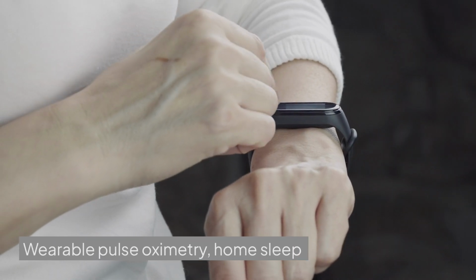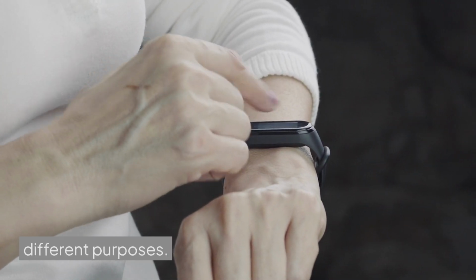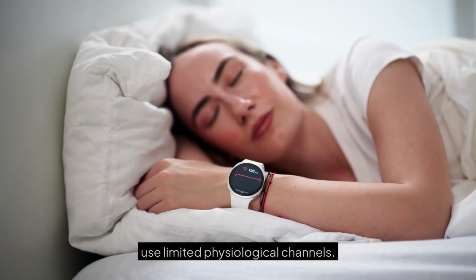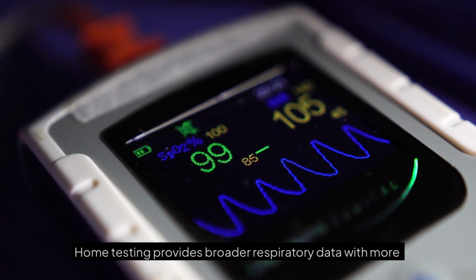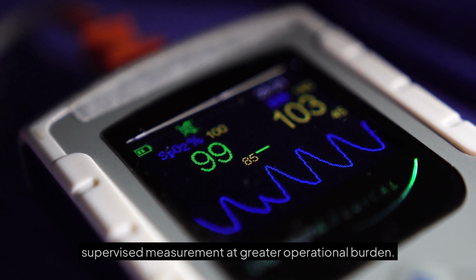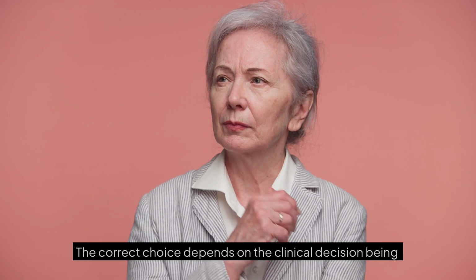Wearable pulse oximetry, home sleep testing, and polysomnography serve different purposes. Wearables offer convenient overnight trend capture but use limited physiological channels. Home testing provides broader respiratory data with more setup, while polysomnography delivers comprehensive supervised measurement at greater operational burden. The correct choice depends on the clinical decision being supported.